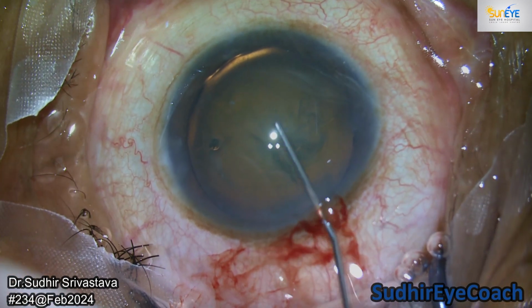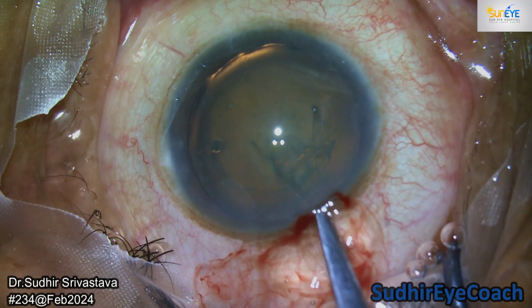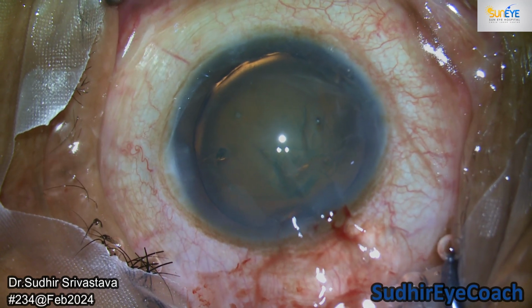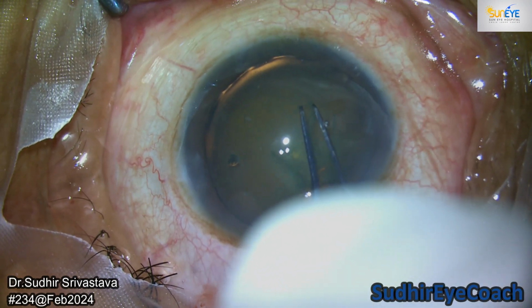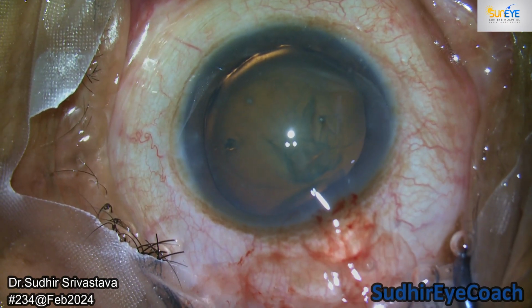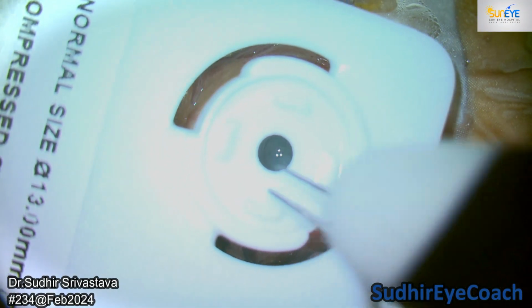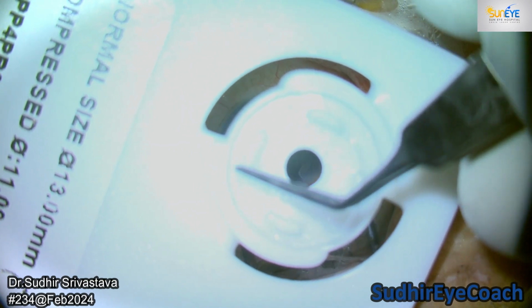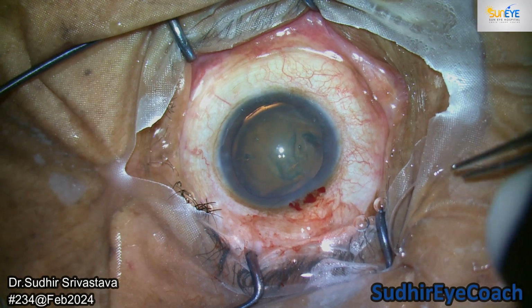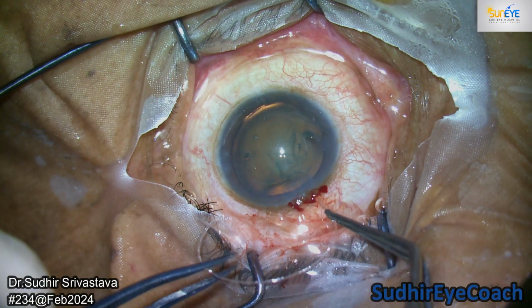Use of proper viscoelastics in such cases is very important. So always keep a combination of all sorts of viscoelastics in your theater. Here, because I found that the rhexis is smaller, I created another nick in the area of the capsule and slightly enlarged it, because if your capsular opening is small during phacoemulsification, we give more traction to the capsule, and because the capsule is already weaker, you can encounter capsular problems.